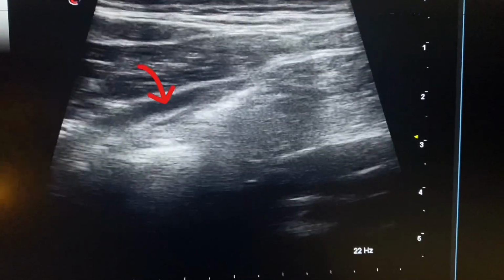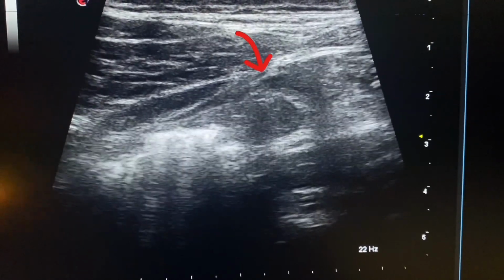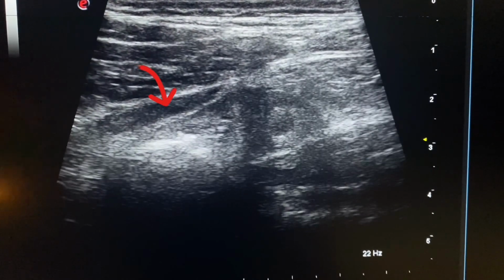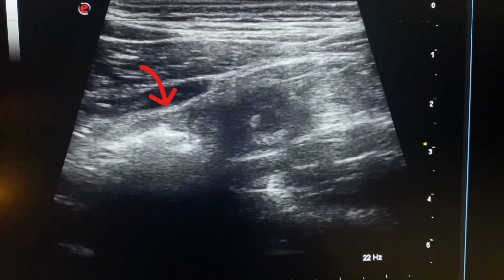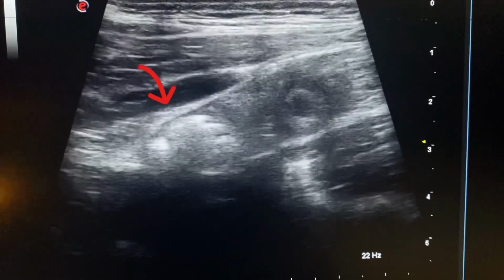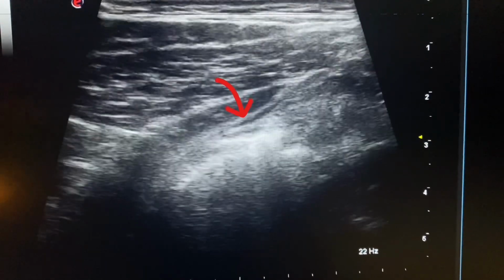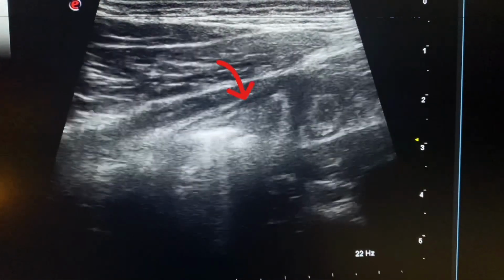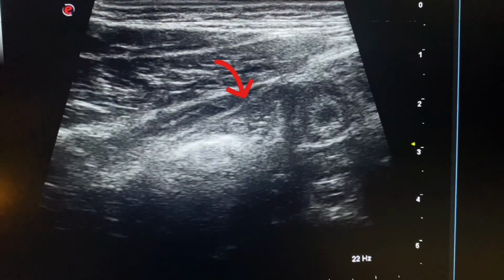Here we see the walls of the gut tube are more prominent and thickened and become an enlarged part of the intestine. This is the cecum. The gases in the large gut loops appear as bubbles due to haustra. So we can appreciate that this is the large part of the gut, or cecum, due to the gas bubble appearance.